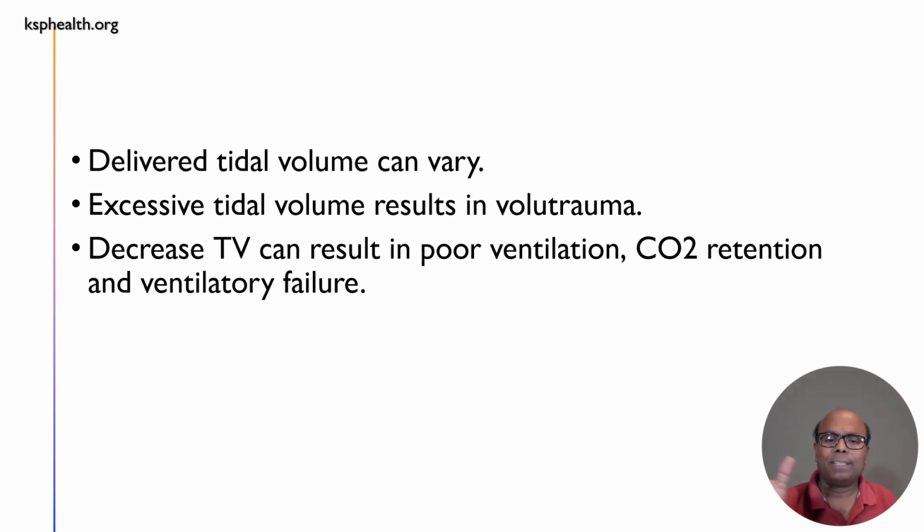But the disadvantage is the delivered tidal volume can vary. Excessive tidal volume can cause volutrauma. Decreased tidal volume, as happens with decreased compliant patients, they can get less tidal volume as a result, poor ventilation, carbon dioxide retention, and ventilatory failure.